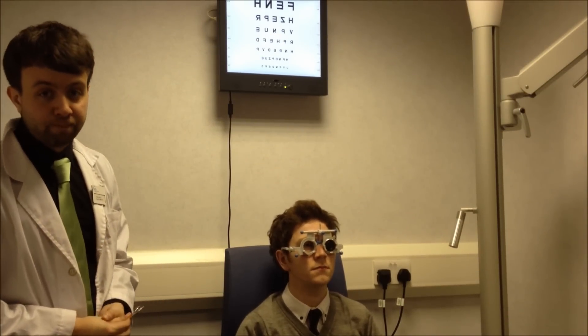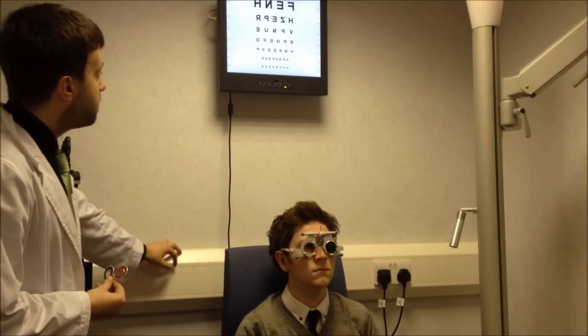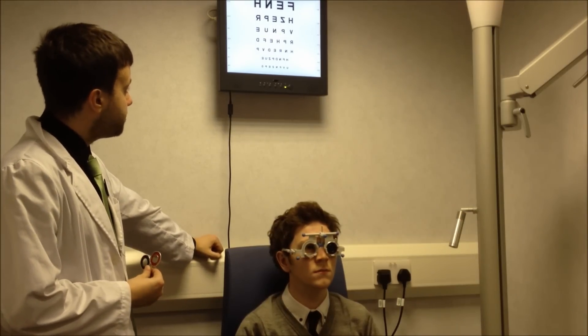To do this we'll do an over-refraction. The first thing we want to do is just get the patient to read the letters on the chart to get their acuity. So Sean, what's the smallest line of letters you can read there for me?